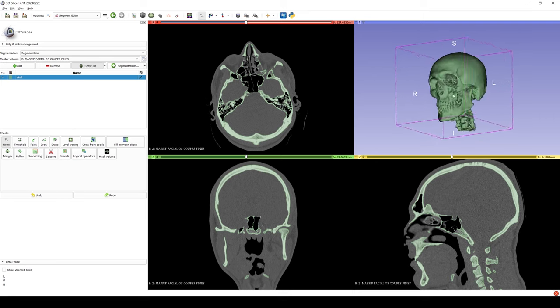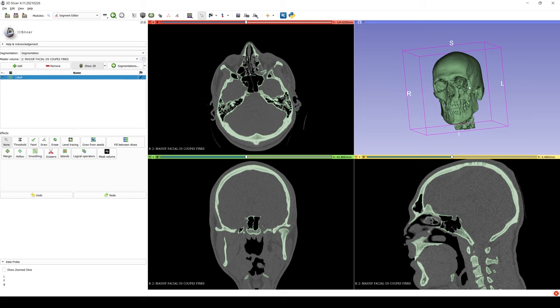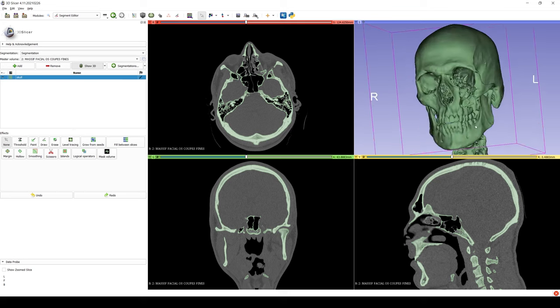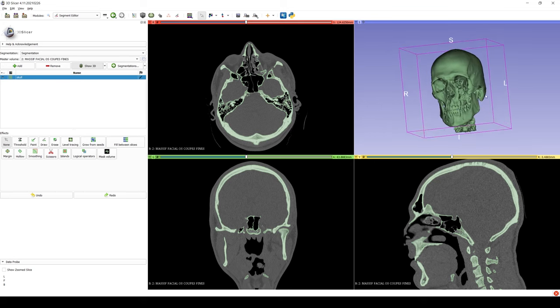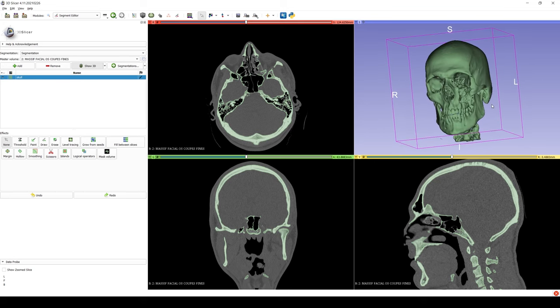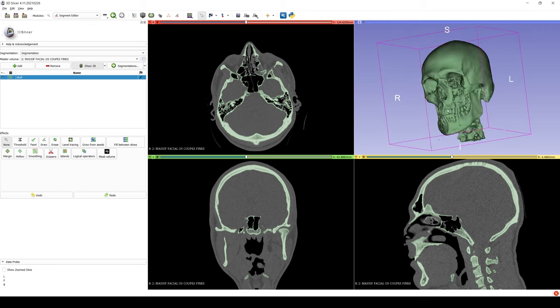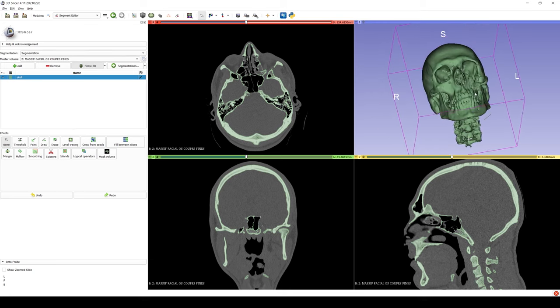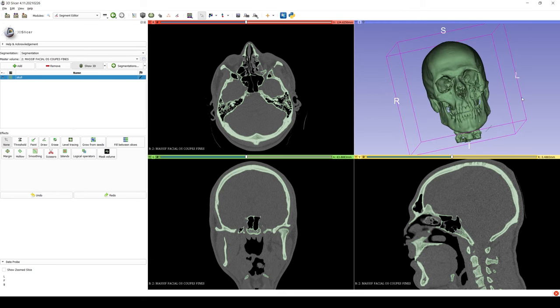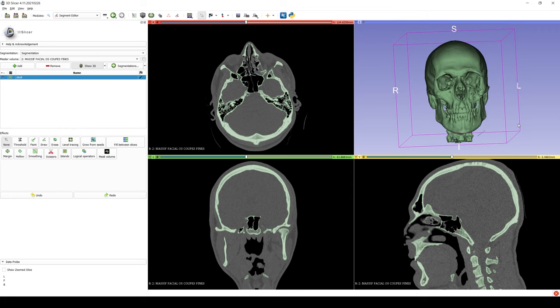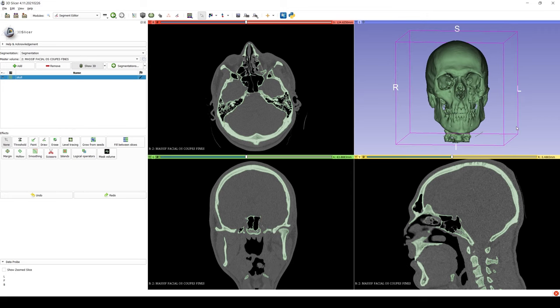Holding down the left mouse pad and dragging moves the image around, while the right mouse pad zooms in and out. If the image gets uncentered, as you can see here, the coronal axis can be controlled by holding down the control button and using your left mouse pad to recenter the scan.